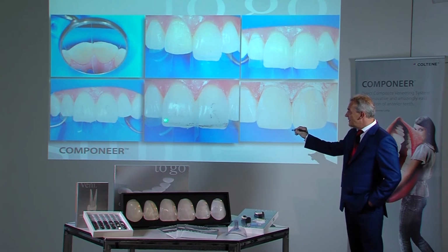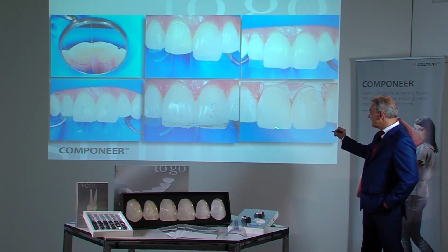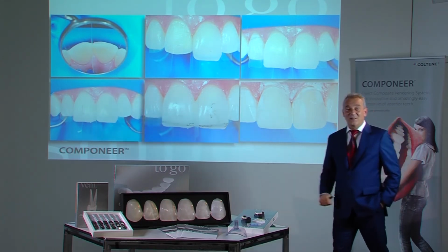It therefore always makes sense to design the incisor edges somewhat longer. This offers an elegant solution to rounding off the distal and mesial edges.